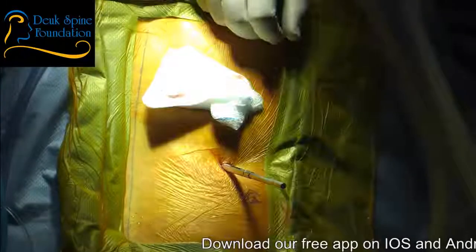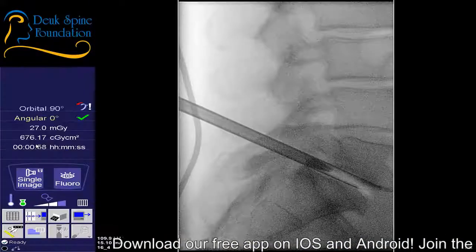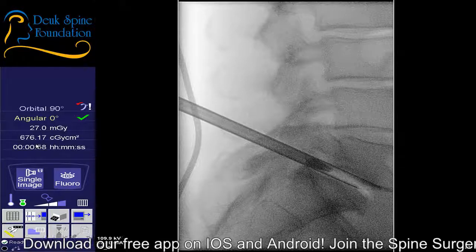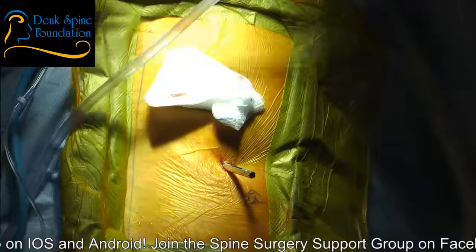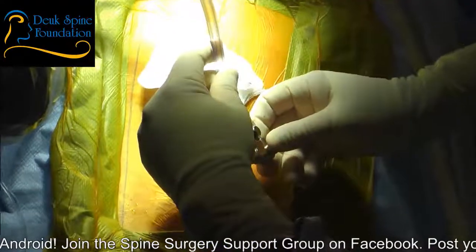We're in like Flynn. Let's just make sure. That's our tubular retractor. I see it now. Yep, we're in. All right, we're in good and far. Can actually pull it back a little bit. All right, let's go ahead and get the scope in, flow out. I'm going to pull this back a little because we're in a little further than I want to be.